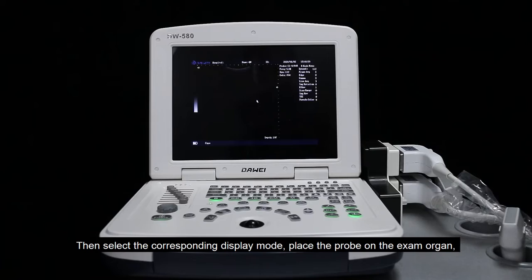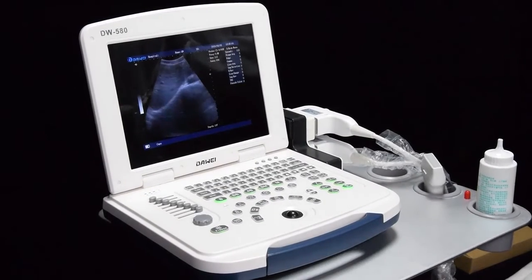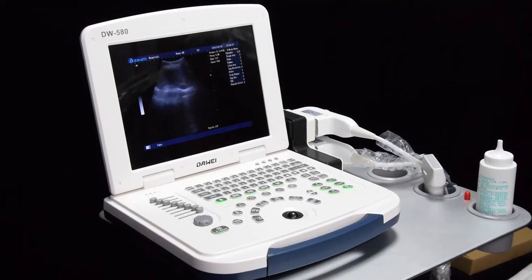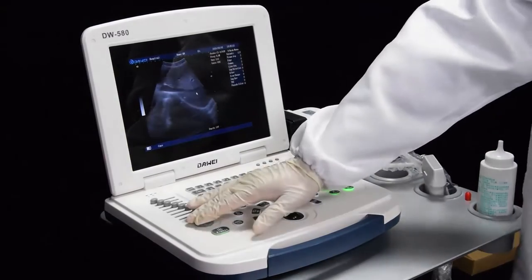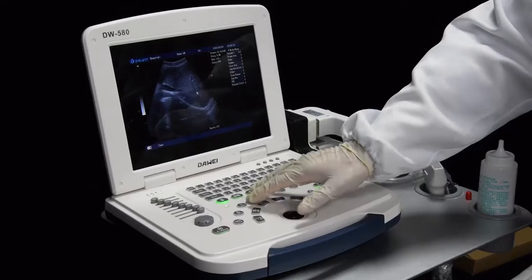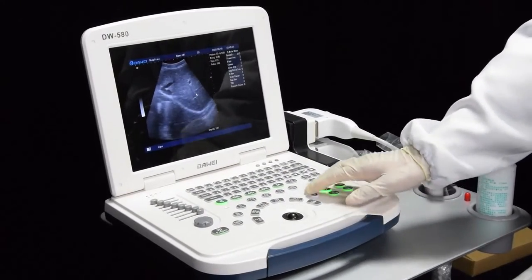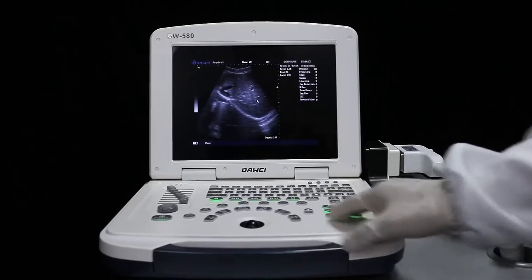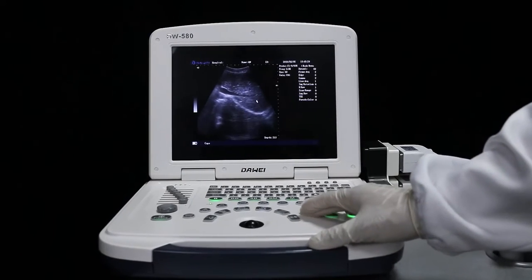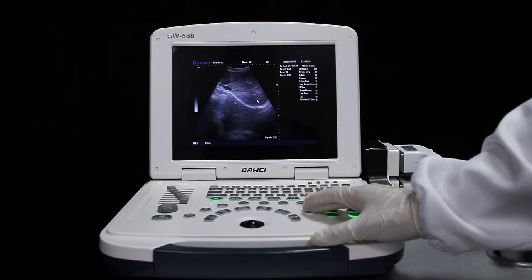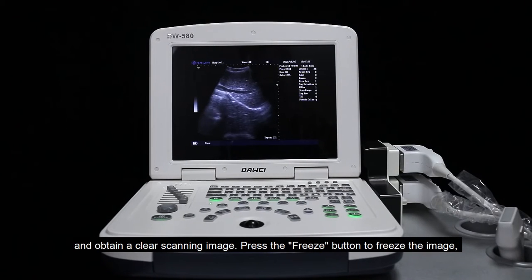Place the probe on the exam organ to obtain the real-time scanning image. Adjust the gain, frequency, dynamic range, and other parameters to obtain a clear scanning image.